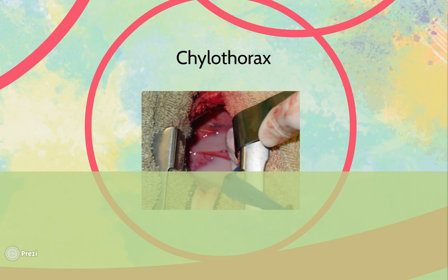So when you have a chylothorax, when we take the fluid off the chest or out of the abdomen, it comes out as white or pink, and it's opaque. So it's very, very chalky white, opaque, or slightly hemorrhagic, might be pink. And when you spin it, it doesn't fully clear. So the supernatant will never go clear. Even though it's lymphatic fluid, you tend not to see a ton of lymphocytes in it. It tends to have fairly low cellularity.